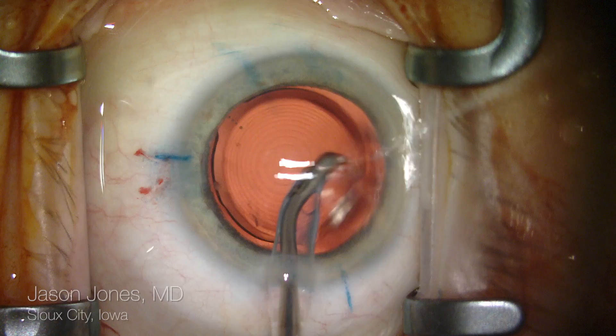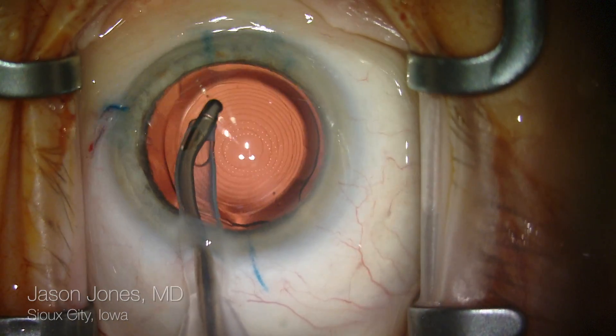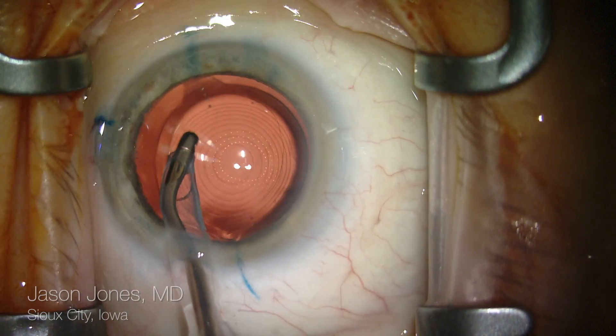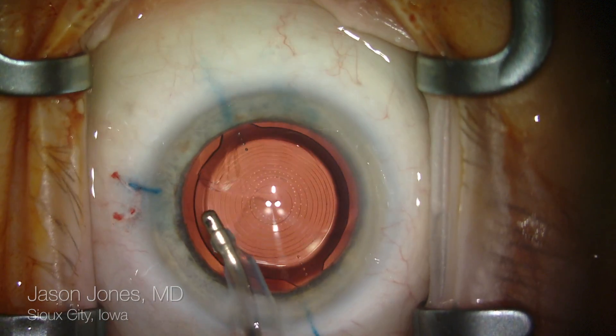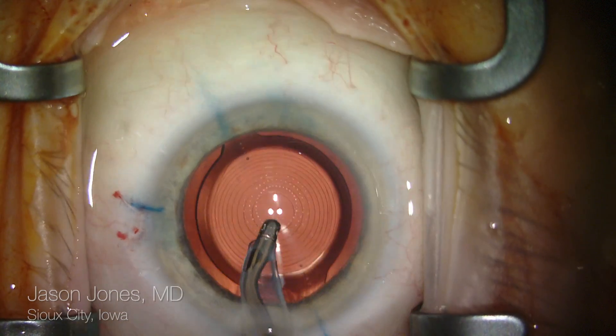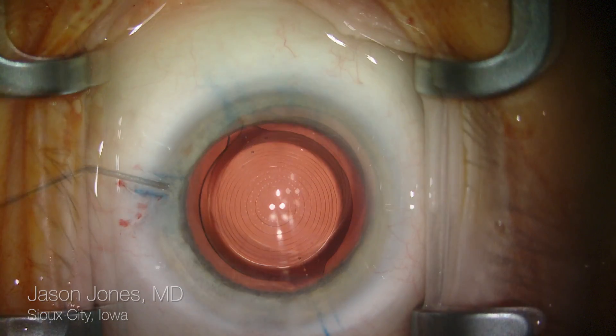It is important to have thorough evacuation of viscoelastic from behind the optic as well as from the anterior chamber. Then I'll gently nudge this lens into position, observing my orientating marks on the IOL as well as the limbus, looking for at least a parallel orientation in this slightly oblique case at 32 degrees.